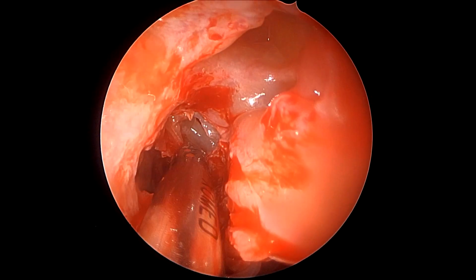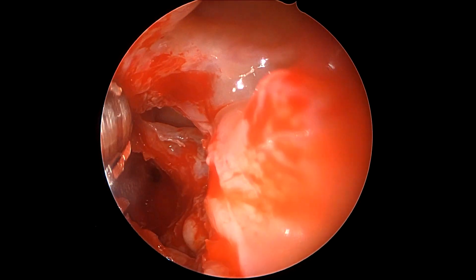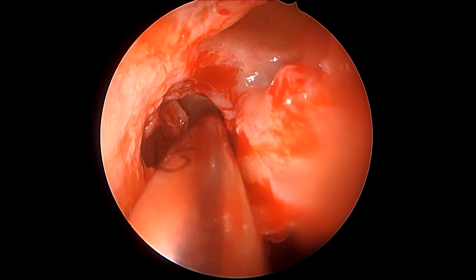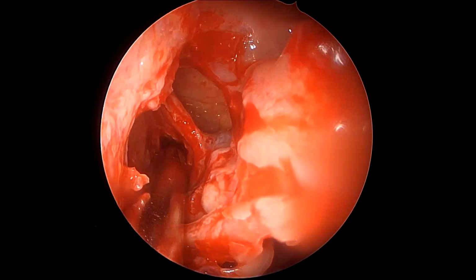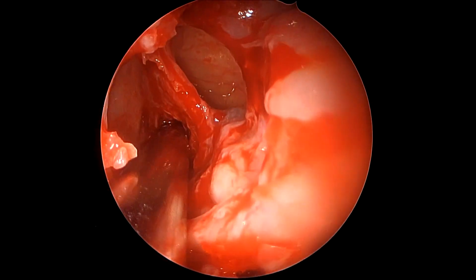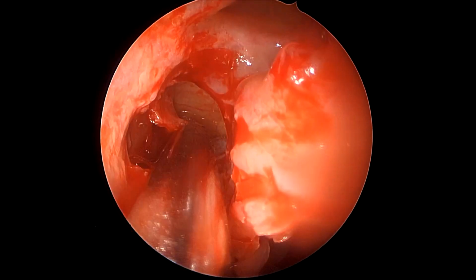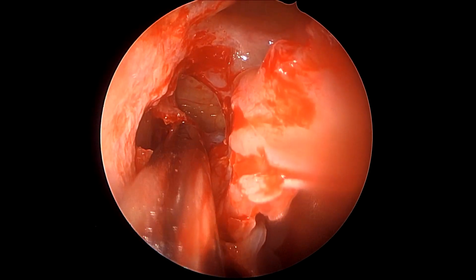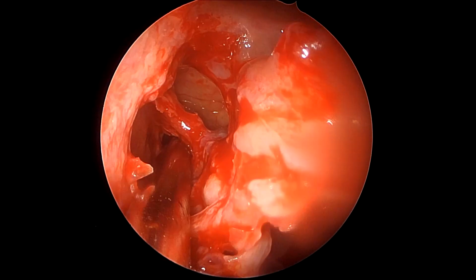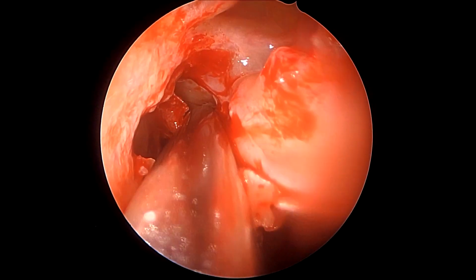One thing to be borne in mind, very important, is the fact that merely opening the sphenoid and not opening the posterior ethmoids adequately is also a telltale recipe for surgical failures, because only when all the sinuses, all the ethmoid septations are taken down and opened widely is the patient able to really reap the benefits of irrigation of the sinuses using either saline or steroid-infused saline to prevent future recurrences.